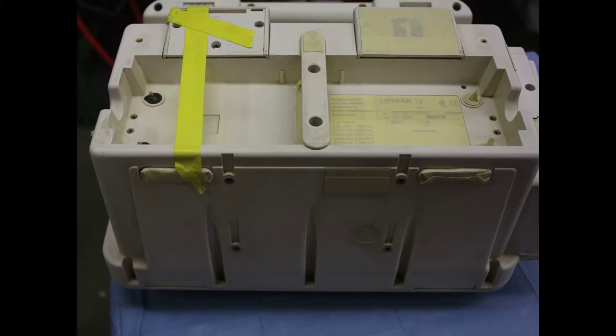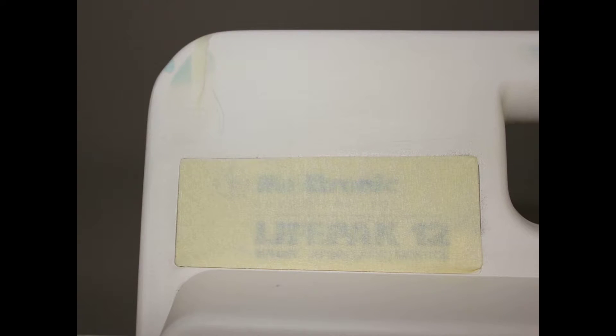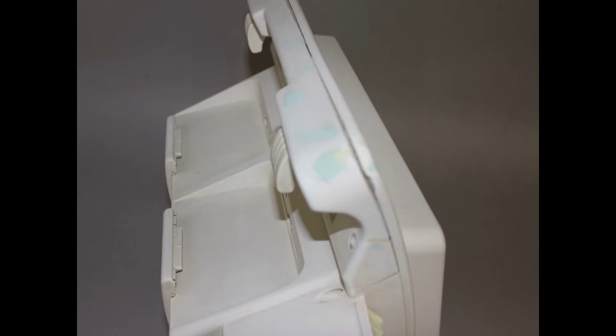After all external damage is repaired, units are taped over to cover sensitive areas, manufacturer's markings, and those surfaces not to be painted. Before painting, some control surfaces are removed to ensure the integrity of the electronics.